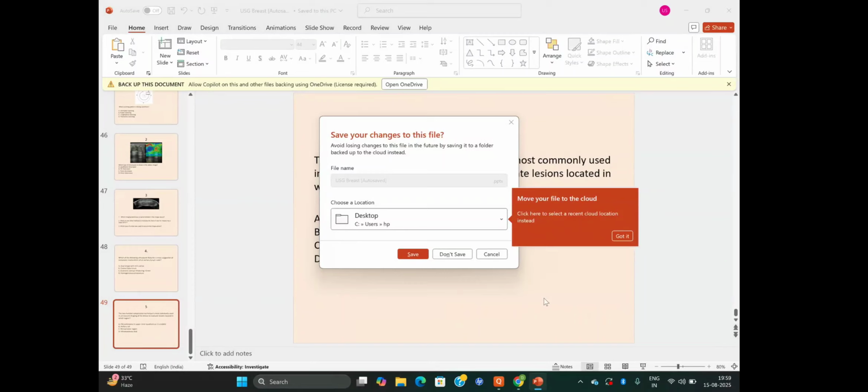Yeah, this question has been asked previously also: why the fat in the breast appears hypoechoic when the rest of the body fat appears echogenic. This is something related to the constitution of the breast, its physical properties. In the breast, it is isoechoic to hypoechoic, whereas fat in the rest of the body appears echogenic. And this was the answer that was given to me also. It's a composition of physical properties that it appears isoechoic or hypoechoic in the breast when in the rest of the body it appears echogenic.